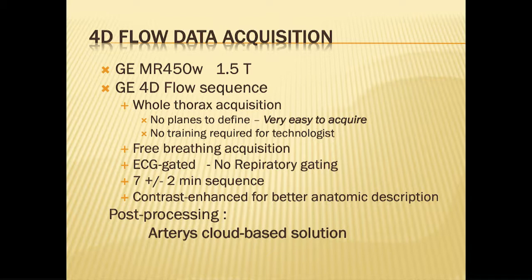For the patient, it's very nice also because it's a free breathing acquisition, which is ECG gated, but without any respiratory gating. Typically, the sequence lasts 7 minutes, plus or minus 2 minutes. So in two words, it's an easy acquisition.